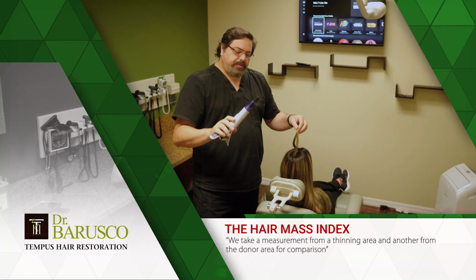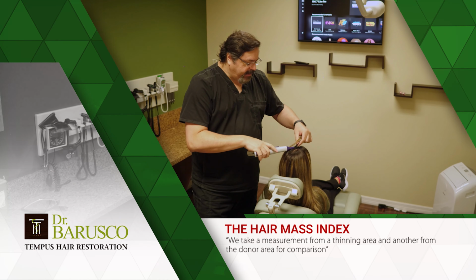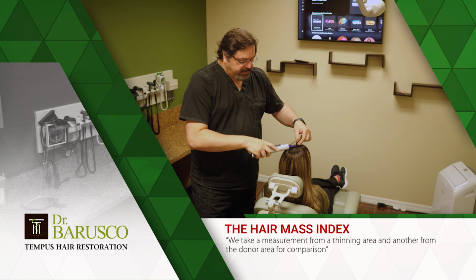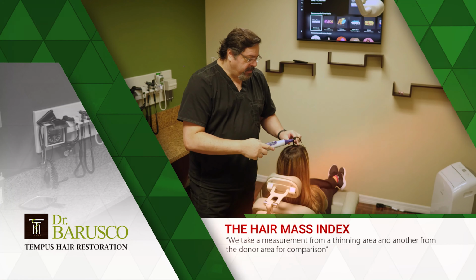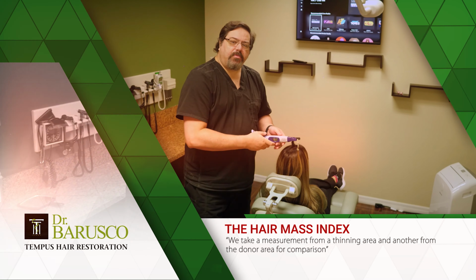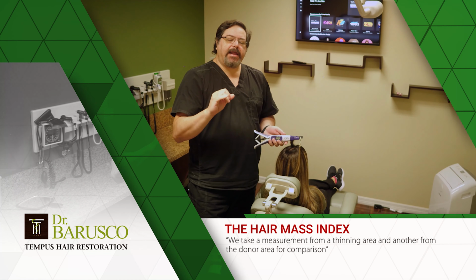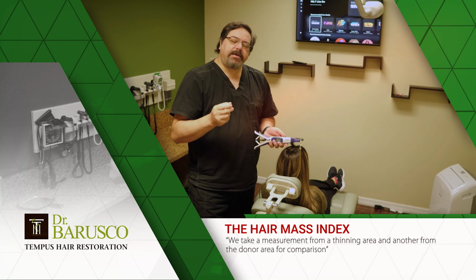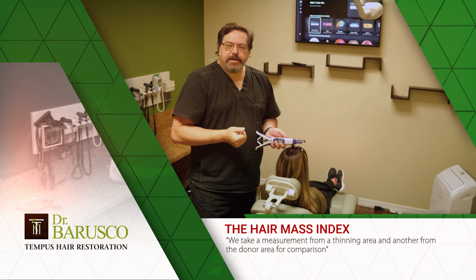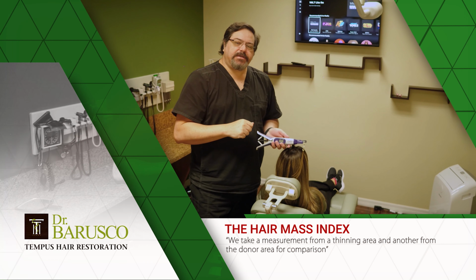So then what we do is we put it inside this little device here, go all the way down to the base of the hair. And we just close the device and it's going to give us a measurement. In her case, it's 130, which is pretty nice. There's no normal or abnormal amount or value here. It depends on your hair. It has to do with the caliber of each hair follicle strand, and also the amount of hair that's in that bundle that we measure. So in her case, 130, and we're going to use that as our baseline to follow successive therapy.